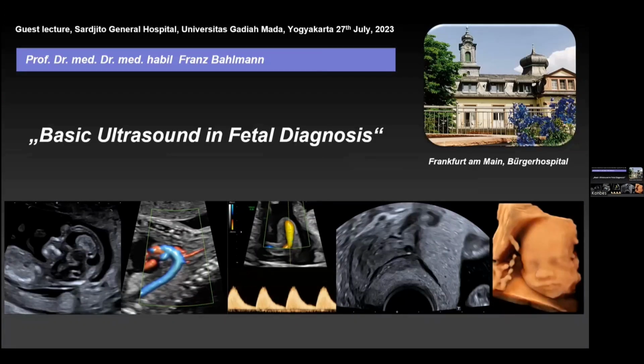We start making ultrasound and try to make such nice images in the first trimester, where we see the profile at 12 weeks, or later for showing the fetal cardiac examination. We can see here the aortic arch. It's also important to get information about hemodynamics with Doppler sonography.